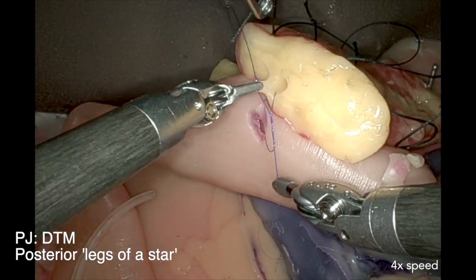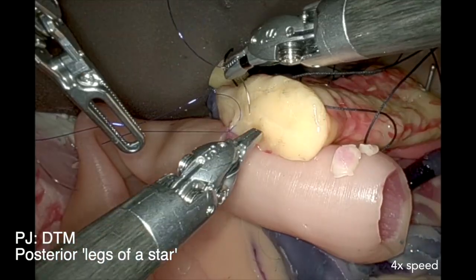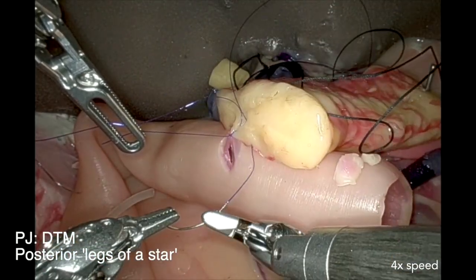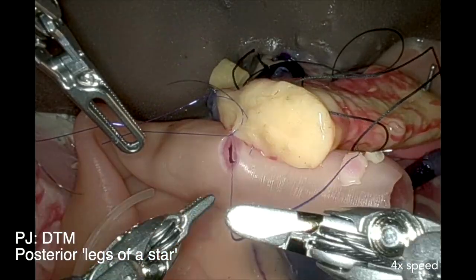The LearnBot method requires five sutures corresponding with the shape of a star. So the posterior duct-to-mucosa sutures are the legs of a star and should be placed accordingly.